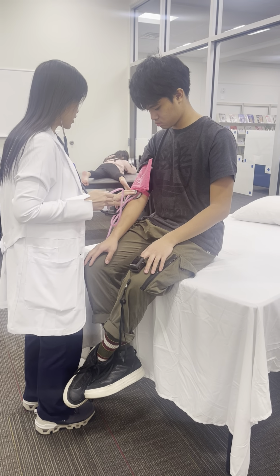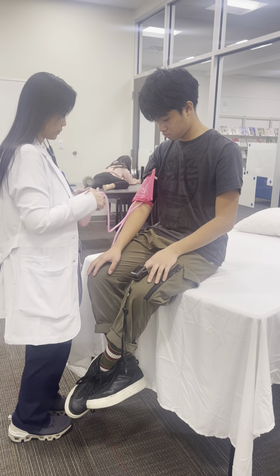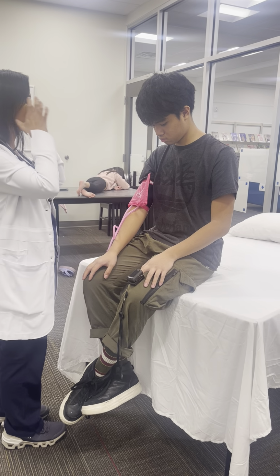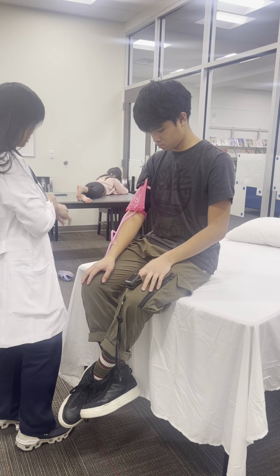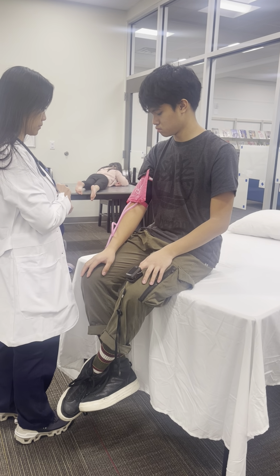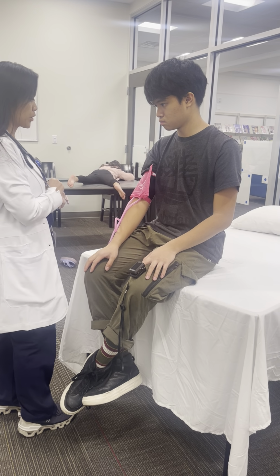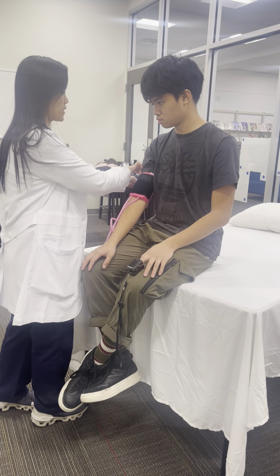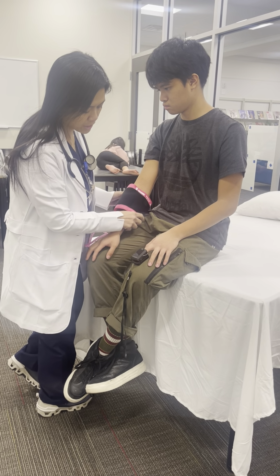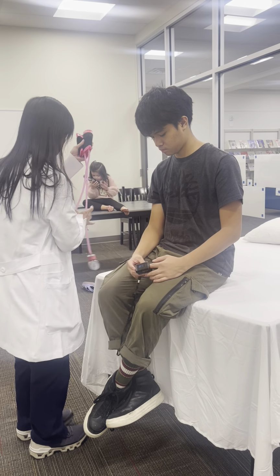Okay, so it's 110/67. Now I'm just counting your respiration. Okay, respiration is 18, and then your oxygen saturation is 95 and your heart rate is at 62. Any questions? One second.